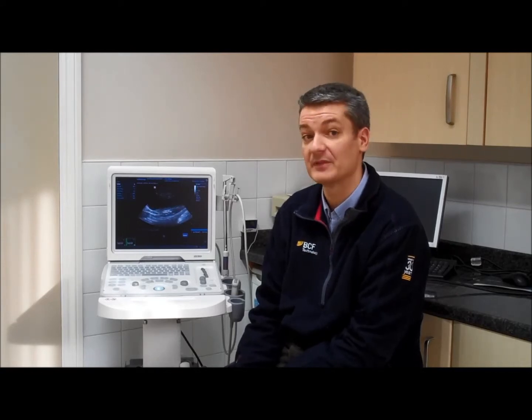The difference that you'll really see is in image quality. It's the very latest technology and the image quality is absolutely superb, especially for the money that you're paying.